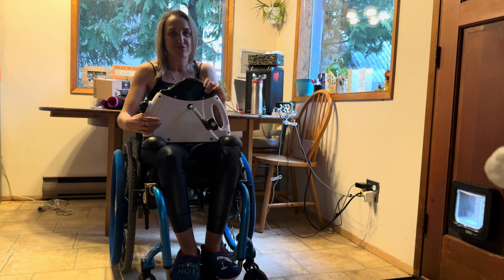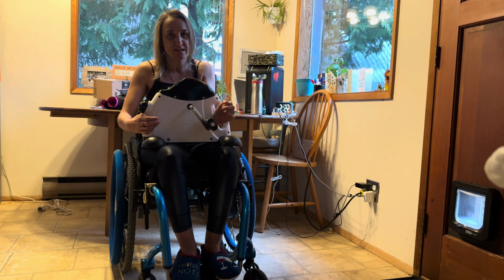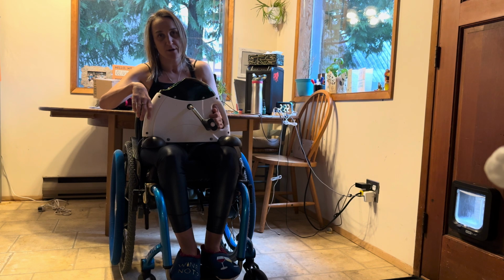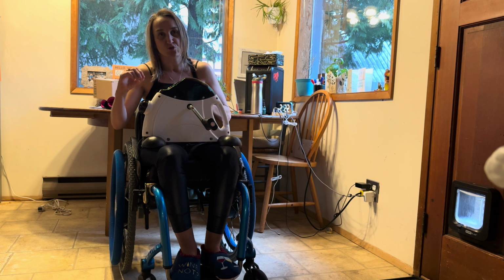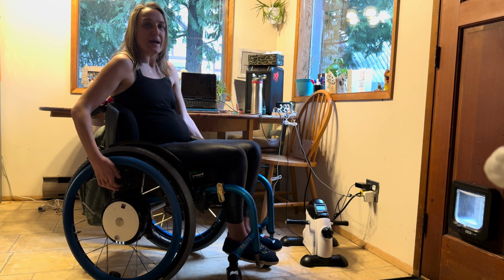And one thing that you have to be looking for is basically a bike that's not too heavy, so you're able to lift it up and put it on the table. And then also that has a handle at the back where you're able to fit your wrist in or your hand in to be able to lift it up. And then in the front of the bike, I also have this resistance lever to make the resistance harder or easier. And that has big dents and stuff in it. So when you are on your Handbike, if you have limited hand function and you're pedaling around, you're able to use your chin to increase or decrease the resistance. So now putting the bike on the table.